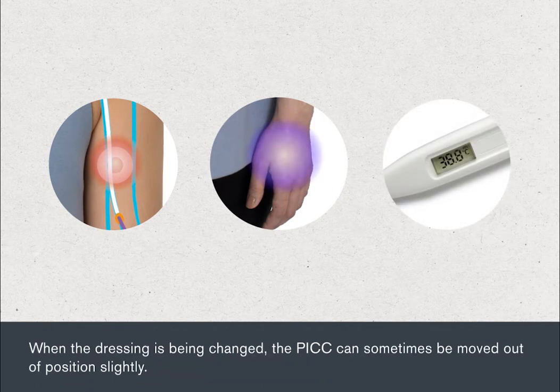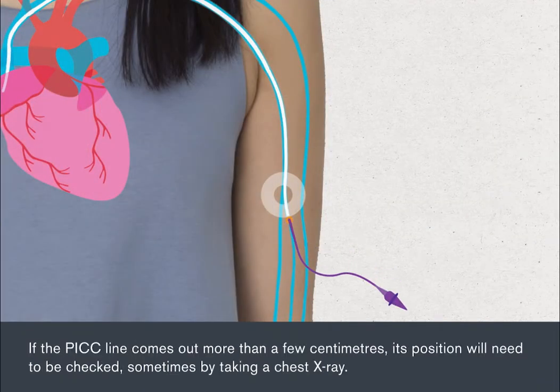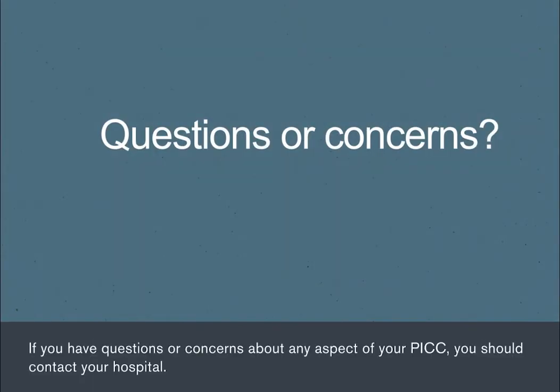When the dressing is being changed, the PICC can sometimes be moved out of position slightly. If the PICC line comes out by more than a few centimetres, its position will need to be checked, sometimes by taking a chest X-ray. If you have questions or concerns about any aspect of your PICC, you should contact your hospital.